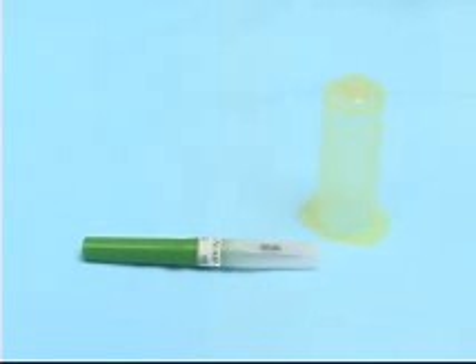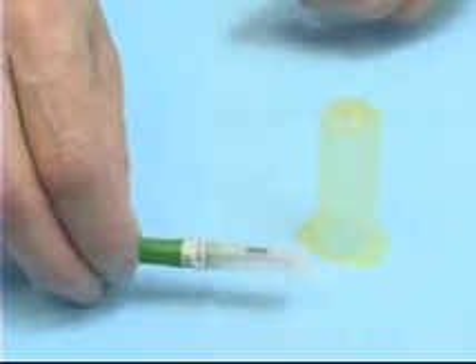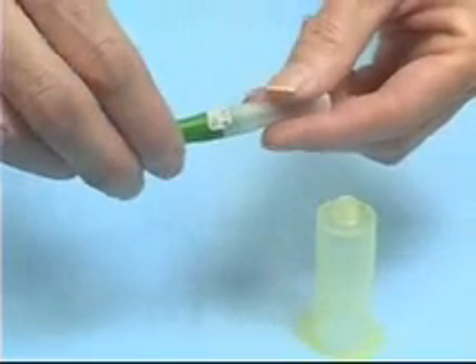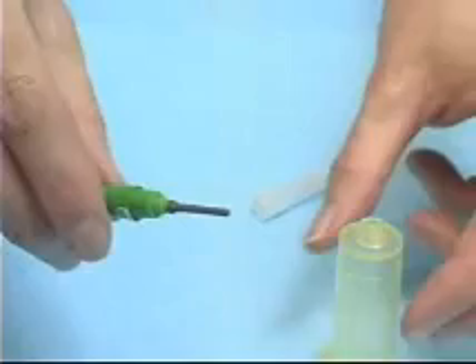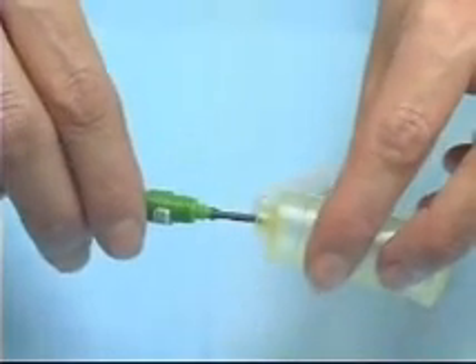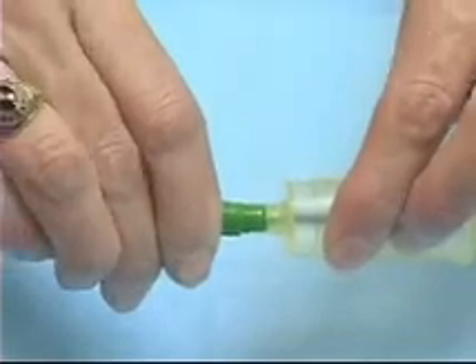In order to use the vacutainer, we need to put the vacutainer needle inside the vacutainer holder. I'm going to remove the clear end from the vacutainer needle and insert it into the vacutainer holder, where it screws tightly into place.